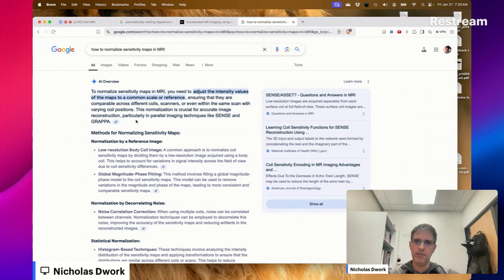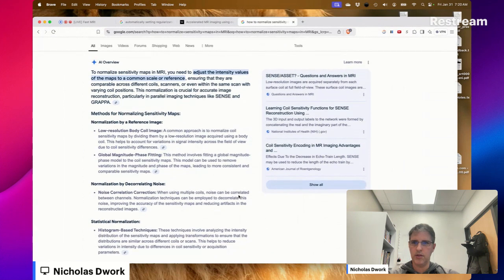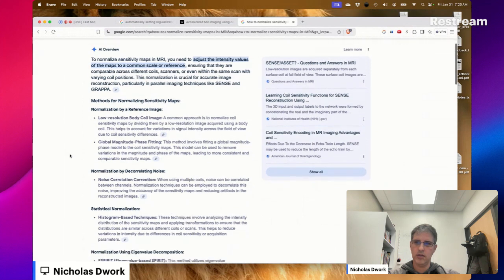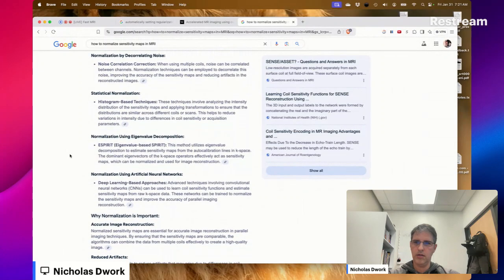Normalization is crucial for accurate image reconstruction, particularly in parallel imaging techniques like SENSE and GRAPPA. Yeah, but how do you normalize these things?